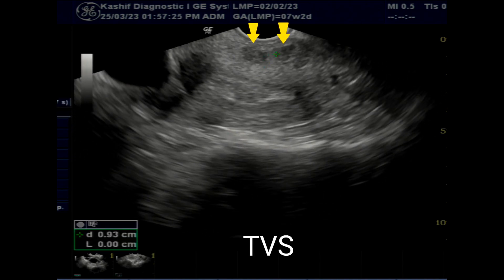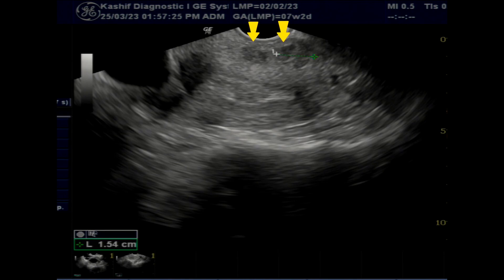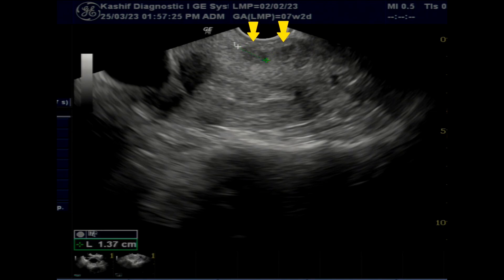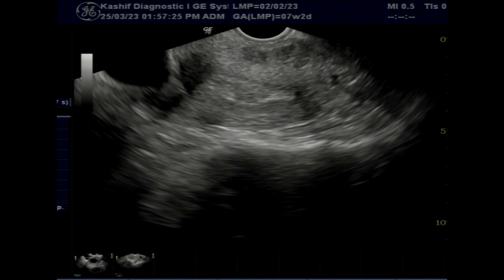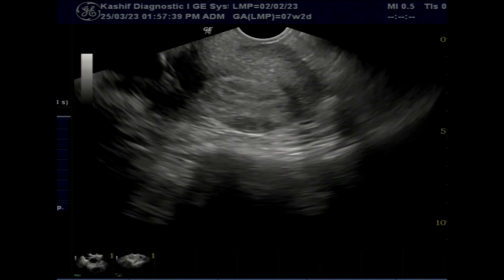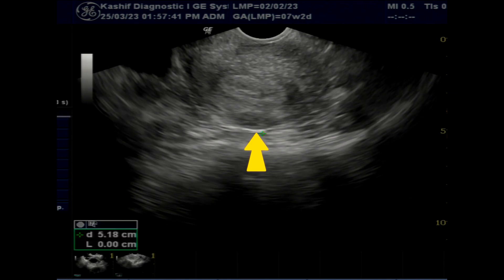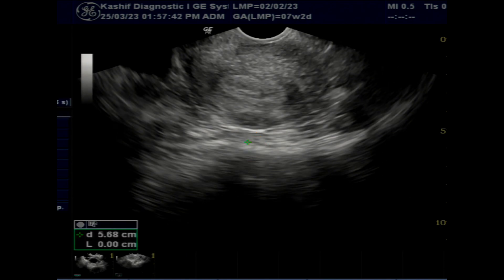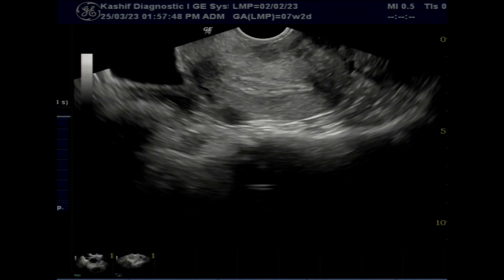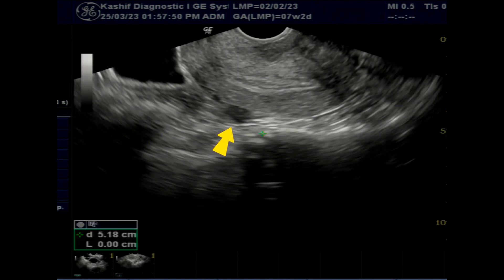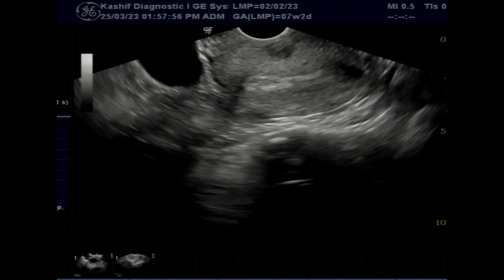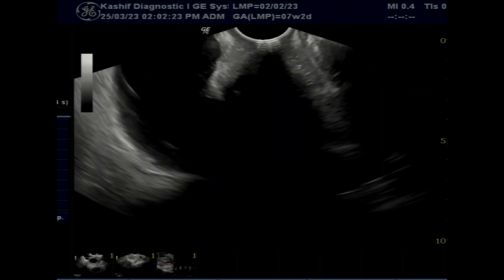The TVS scan gives a clear view of the uterus. First of all, small fibroids are seen — 2 are posterior and 2 fibroids are seen anteriorly; sizes are written in the video. These are intramural type and on the outer side of the myometrial wall. No pushing effects seen on the endometrium.